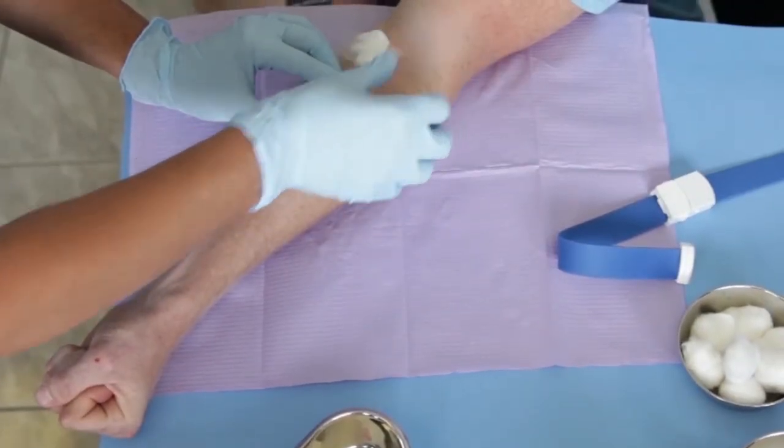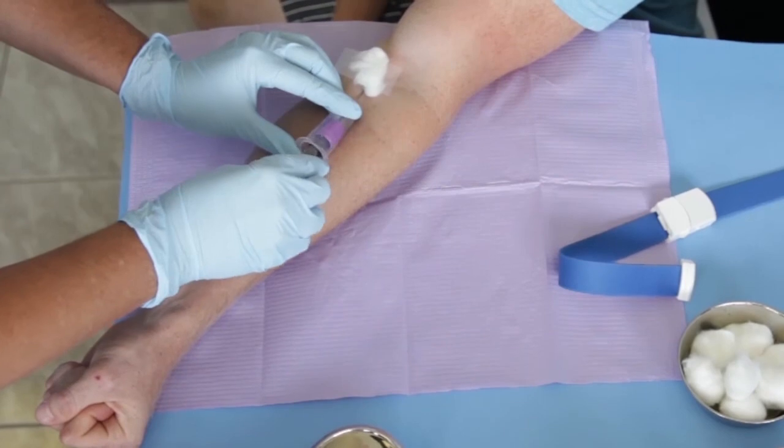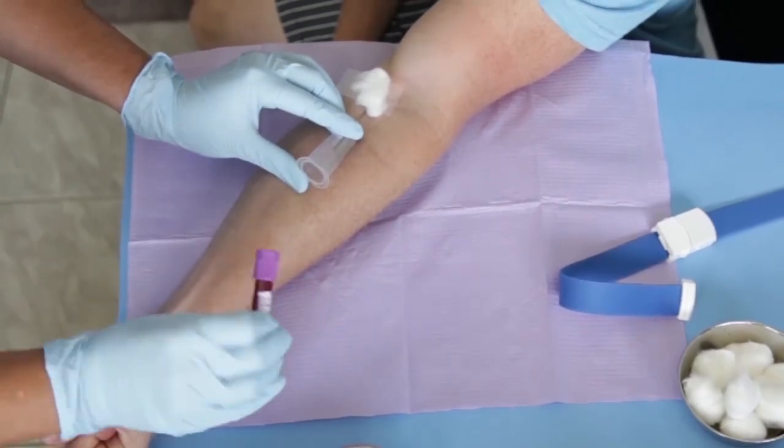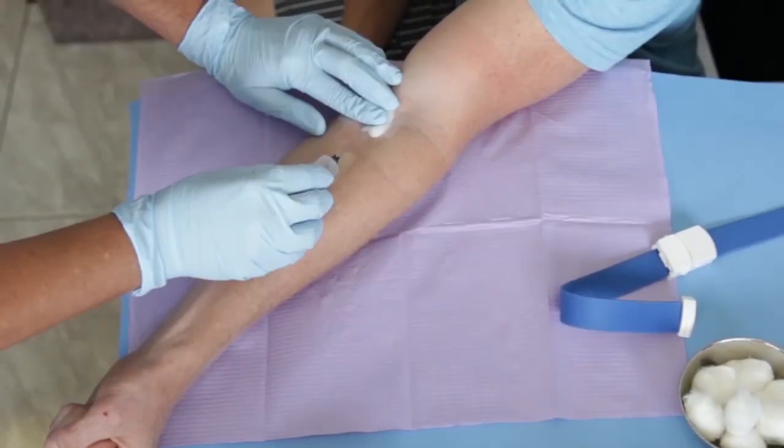Are you ready to start practicing this skill? Go ahead, set up your venipuncture trainer for practicing phlebotomy and have fun.